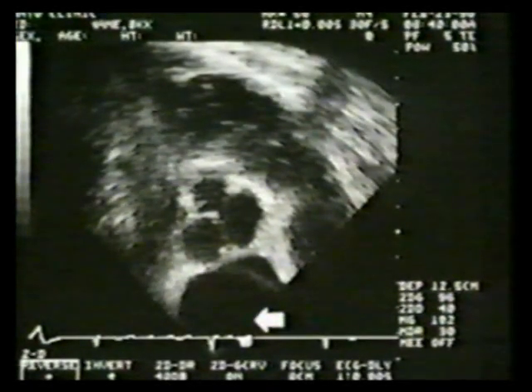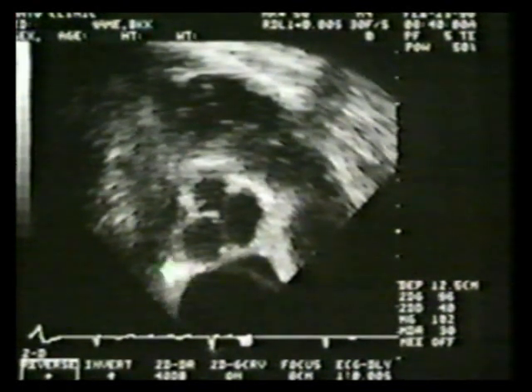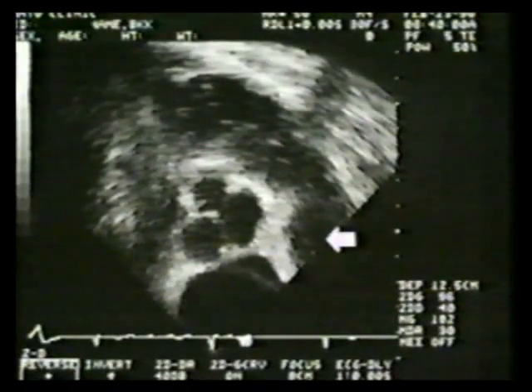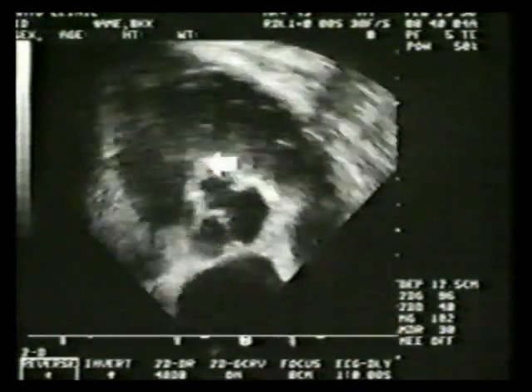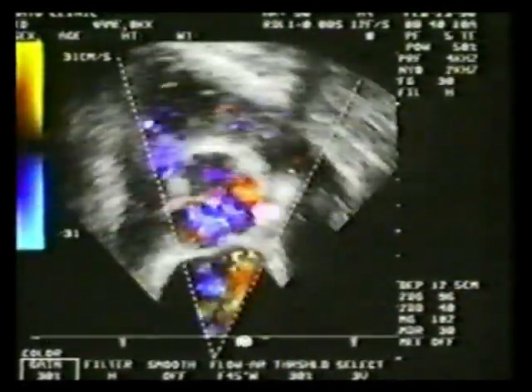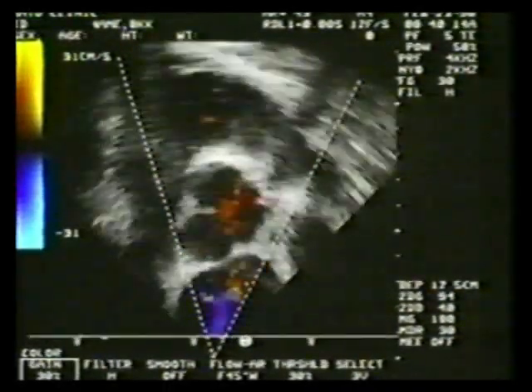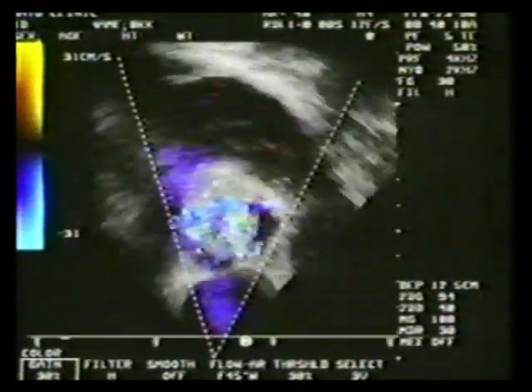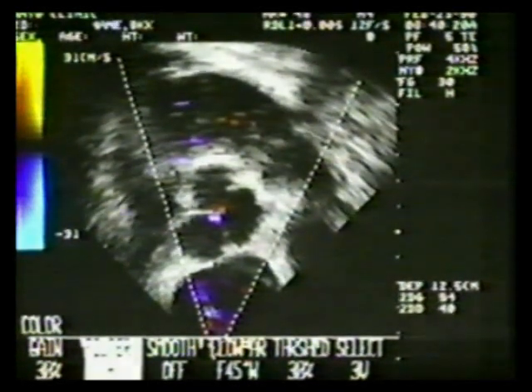This is a longitudinal imaging plane with a transducer adjacent to left atrium. The short axis of aortic cusps are visualized. Anteriorly, the right ventricular outflow tract. The left, right, and non-coronary cusps of the aorta are visualized in short axis. Note that the regurgitant jet occupies a small portion of the left ventricular outflow, consistent with mild aortic valve regurgitation. Biplane transesophageal is superior in assessing the degree of regurgitation.